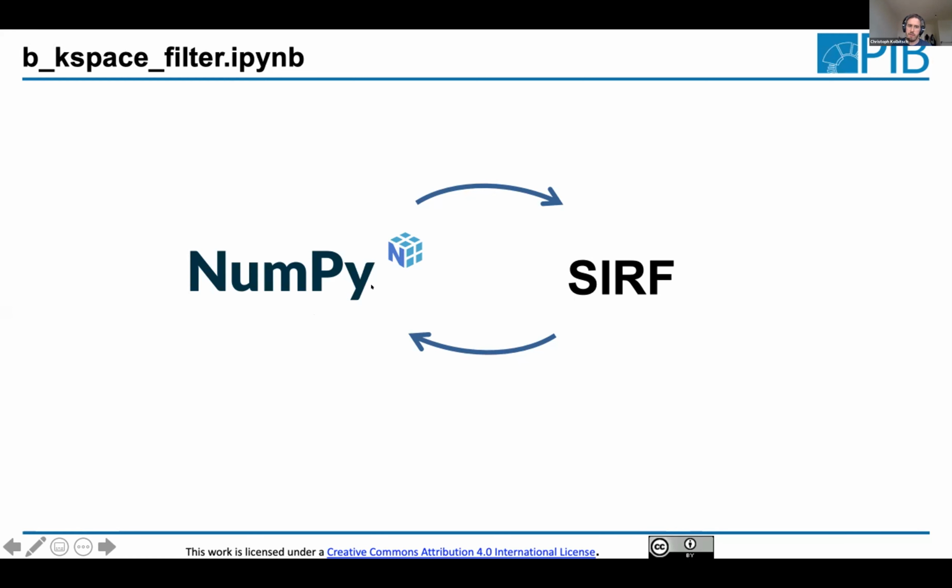You can modify that very easily, and then you can put it back into your reconstruction pipeline. That's a very powerful concept, which sounds quite trivial here, but it means you have this ease of use of the software while still being able to reconstruct very large data sets in a reasonable reconstruction time.